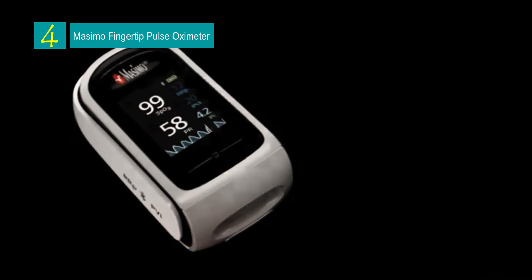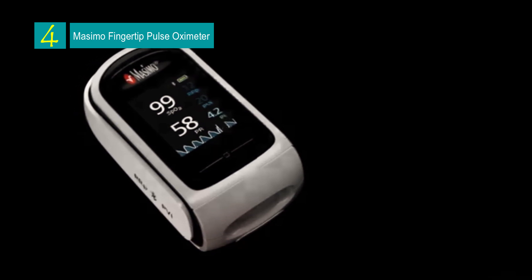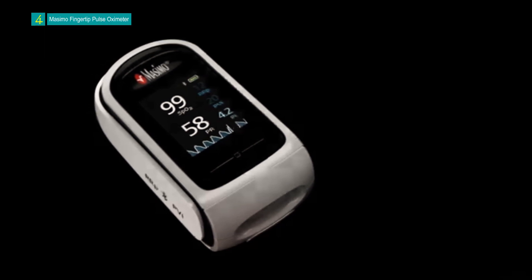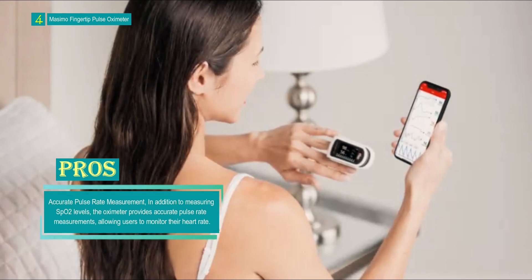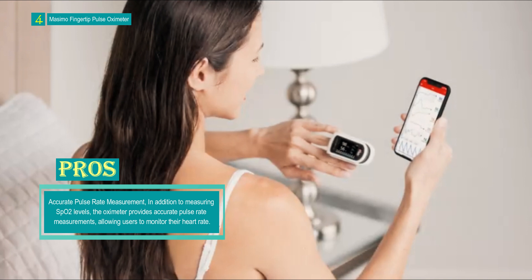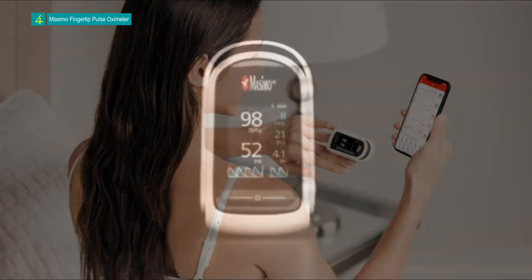Number 4: the Masimo MightySat Fingertip Pulse Oximeter. This is an advanced and reliable device designed to measure blood oxygen saturation levels (SpO2) and pulse rate with accuracy and precision. It comes in an attractive white and black color and is compact and portable, making it suitable for use at home, during physical activities, or while on the go.